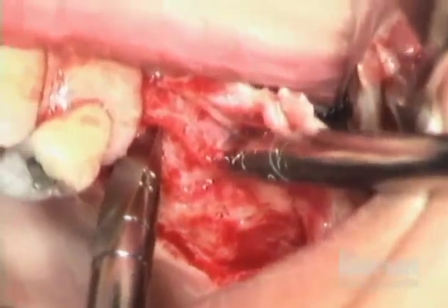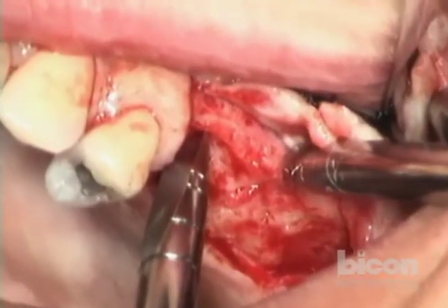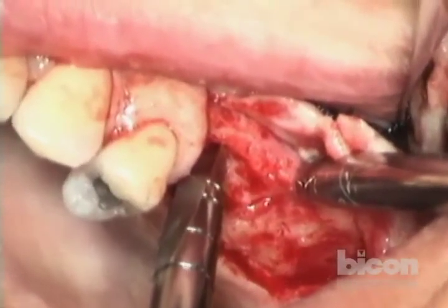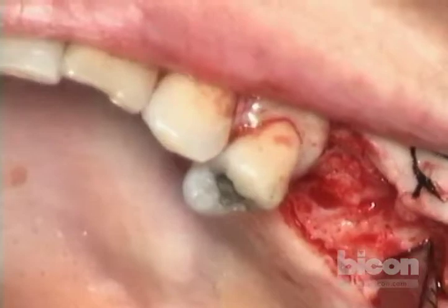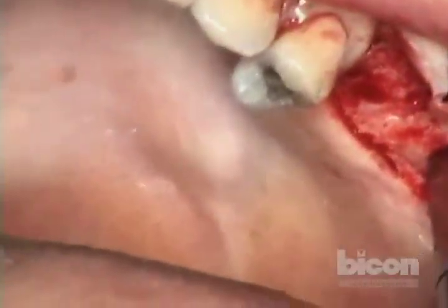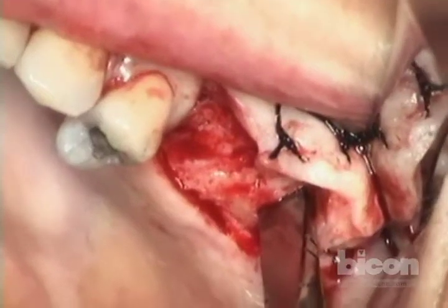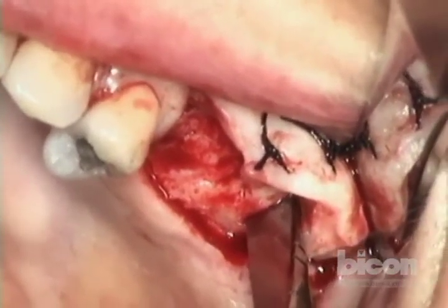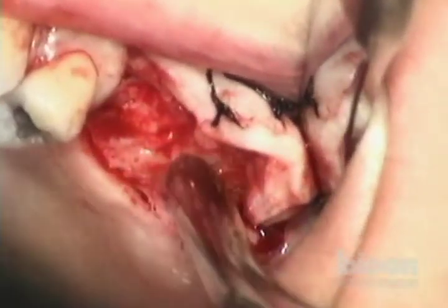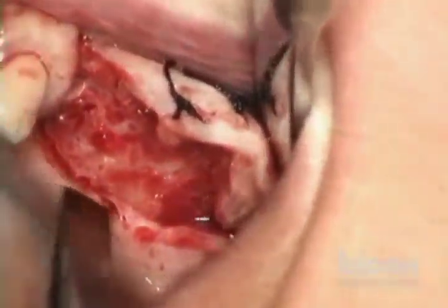If you remember from the x-ray, the mesial and distal sides are different in thickness. The mesial side is significantly thicker; the distal side is not as thick, so you have to keep that in mind. I've now made these two cuts and we're going to make the connecting cuts between the two.